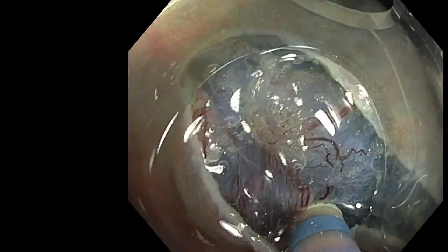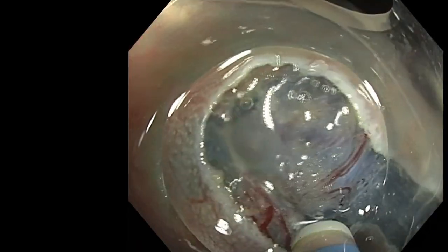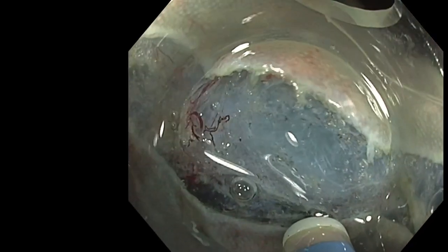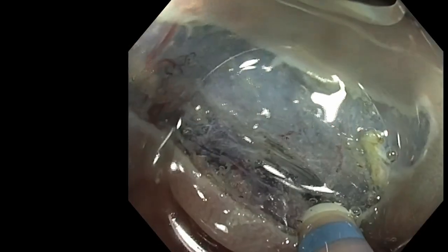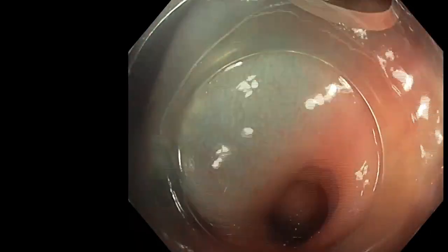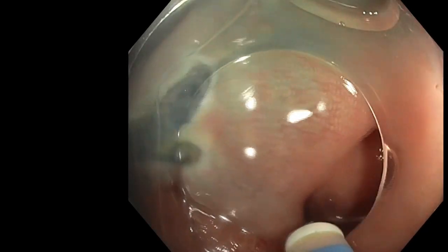Really, you should spend time doing this trimming, because at the end it will help you a lot to fix the traction on this edge, and also to turn around the diverticula once the traction will be on the lesion. So it's very important to spend time doing this injection and this incision on this edge. Once it is performed, we will complete the circumferential incision.